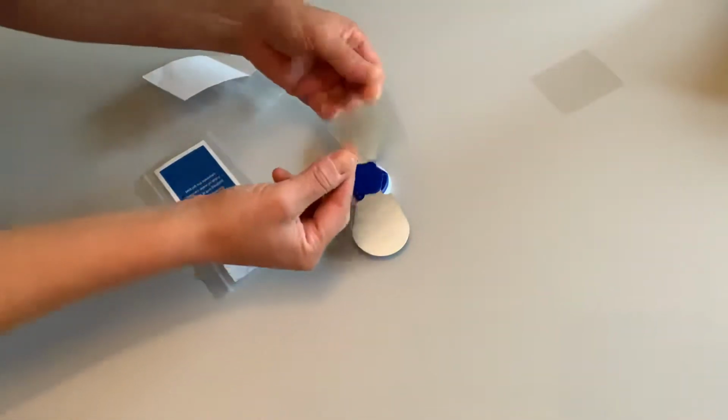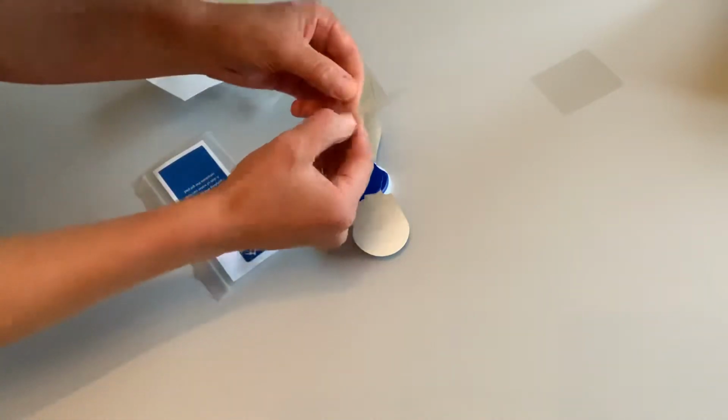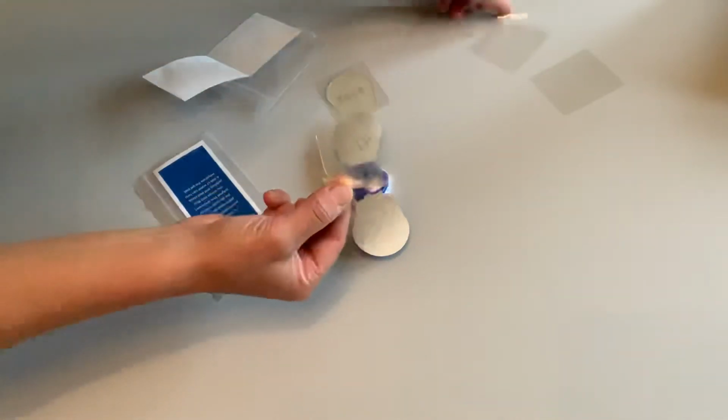and dispose of that. Just being careful that you don't take the gel with you. I'm just holding it back with my right thumb.